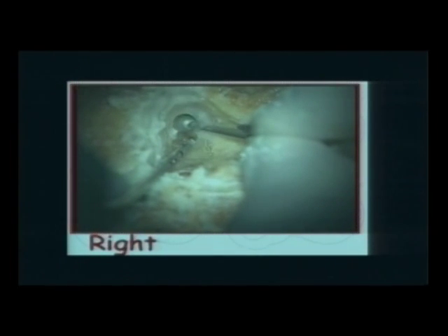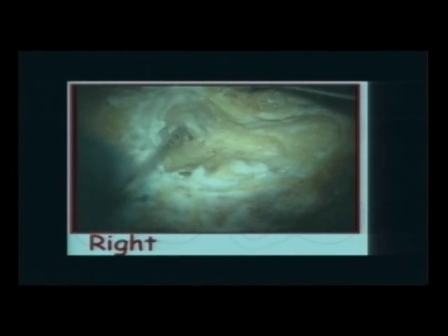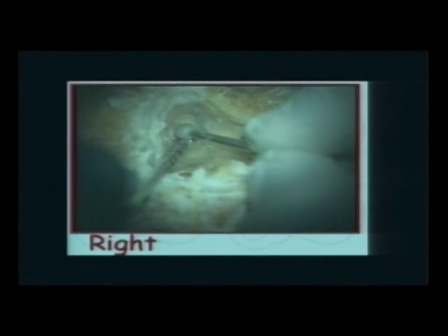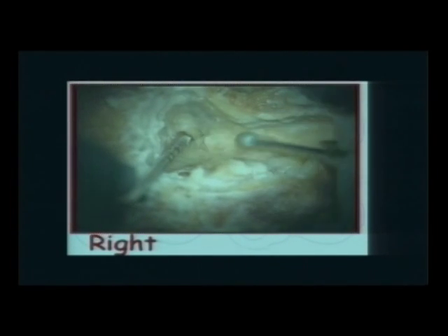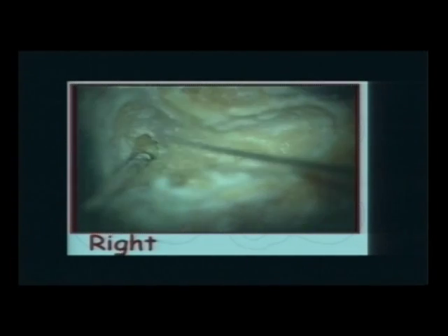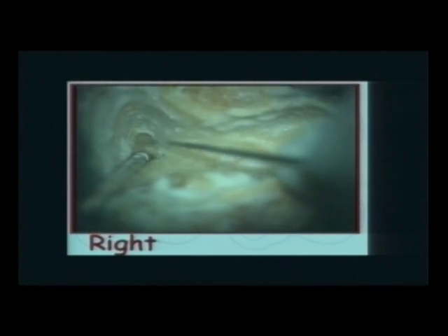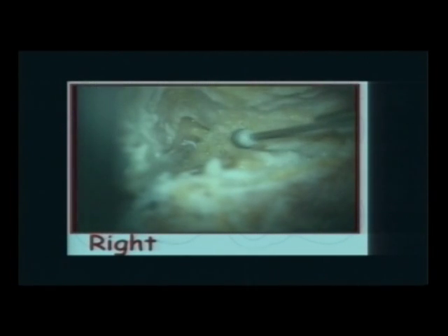The step I'm doing right now, I'm removing bone lateral to the incus. I like to expose the body of the incus. See how I've thinned the canal wall? This canal wall is really thin. You keep on removing bone until the air cells disappear. And it's very thin, but try not to break it, because the biggest problem in cochlear implants, if you break it... This is the lateral semicircular canal. This is the incus here with the malleus in front of it. This is the anterior epitympanum.